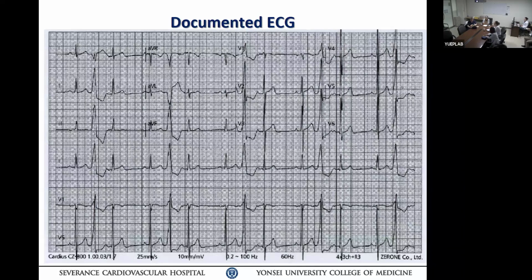So, what information are you trying to get from the total ECG? First place, you need to know what's the rhythm, right? But it's not just that. EKG contains what else? The patient's basic cardiac function. So your interpretation is not even half complete.